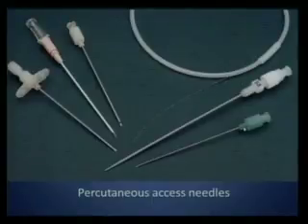So how we use this: we get access into the artery. We pass this wire. Once we pass the wire, we take this needle out. And this is the 5 French micropuncture set. It also comes with a 4 French micropuncture set. It has two components. This inner component is 3 French, and the outer is 5 French. You put a 018 wire, slide this over it, then take the inner component out, and then you can pass a 035 or 038 wire. So you're basically upsizing using a small access.